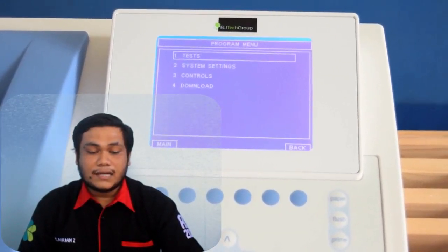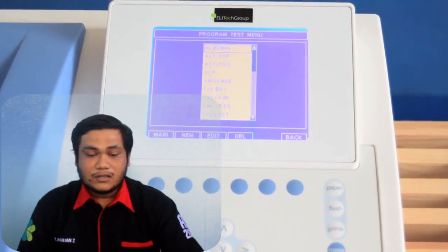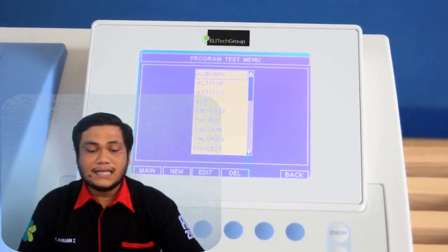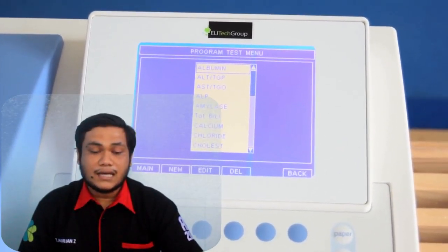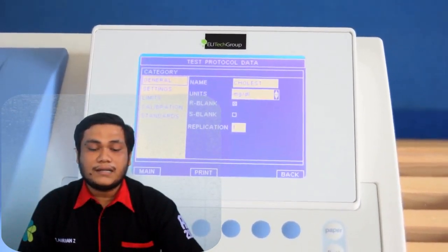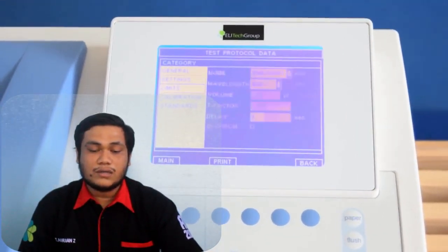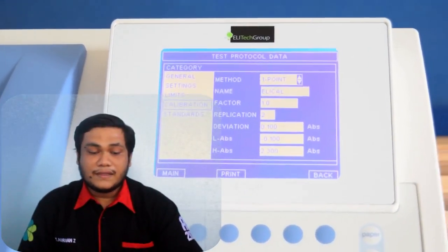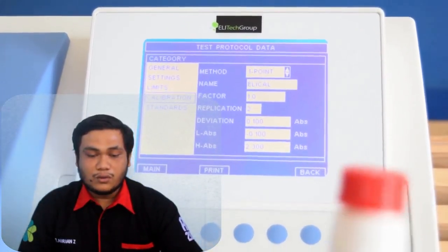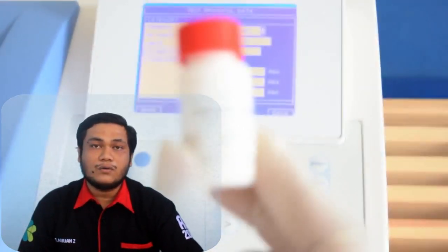Step number 10. Move the pin in hole E to adjust the absorbance value. You will see the absorbance value on the right side of the screen according to the movement of the pin. Then adjust the light to the lowest absorbance value. When you reach the lowest value, both values on the screen show the same value.